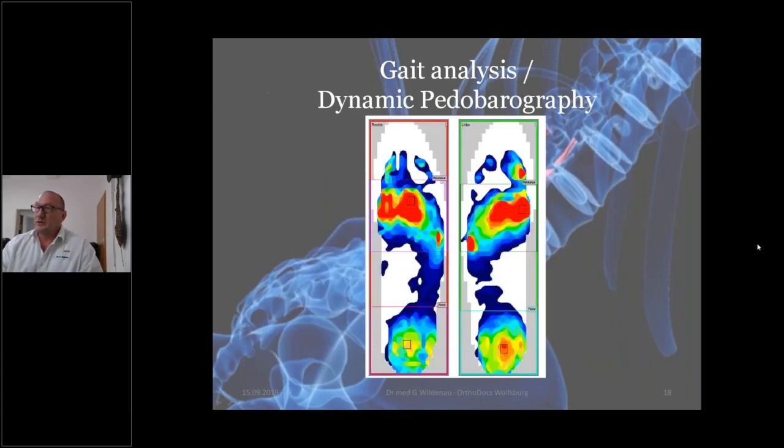Now, sometimes, once we're done with the spine, we also do the dynamic pedobarography to see if there's still something wrong with the feet. We do this at the end of our treatment.